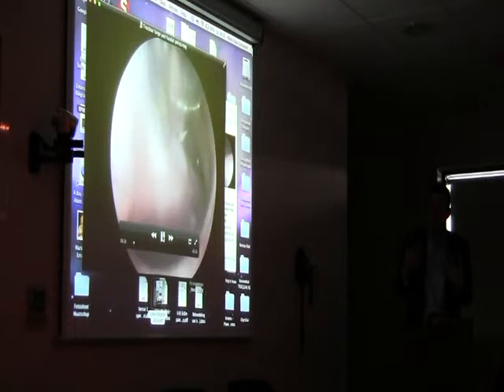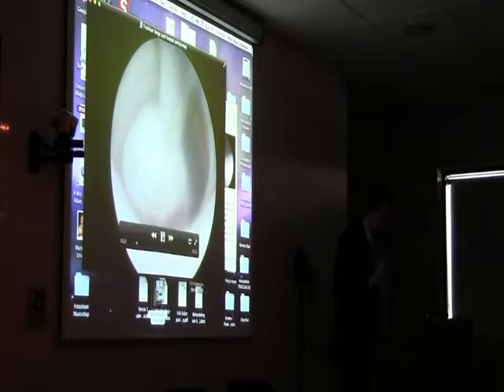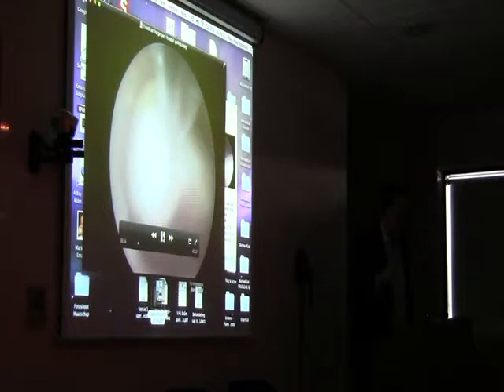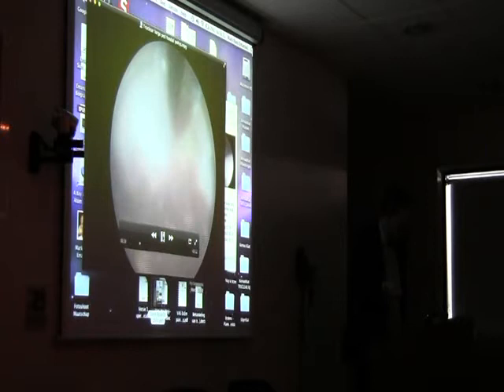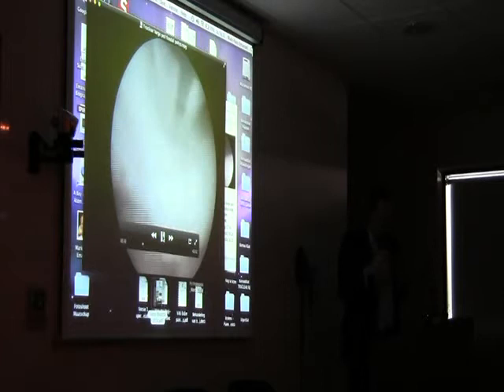But the nice thing about the morcellator is you just literally put it there. And it's also nice in that there's not really a technique. I like to show people it, and I'm trying to portray some competence, but in essence, I'm just shoving it against the polyp. The main thing is you must remember not to fall asleep and actually put some force against it, because otherwise you're just sucking fluid.